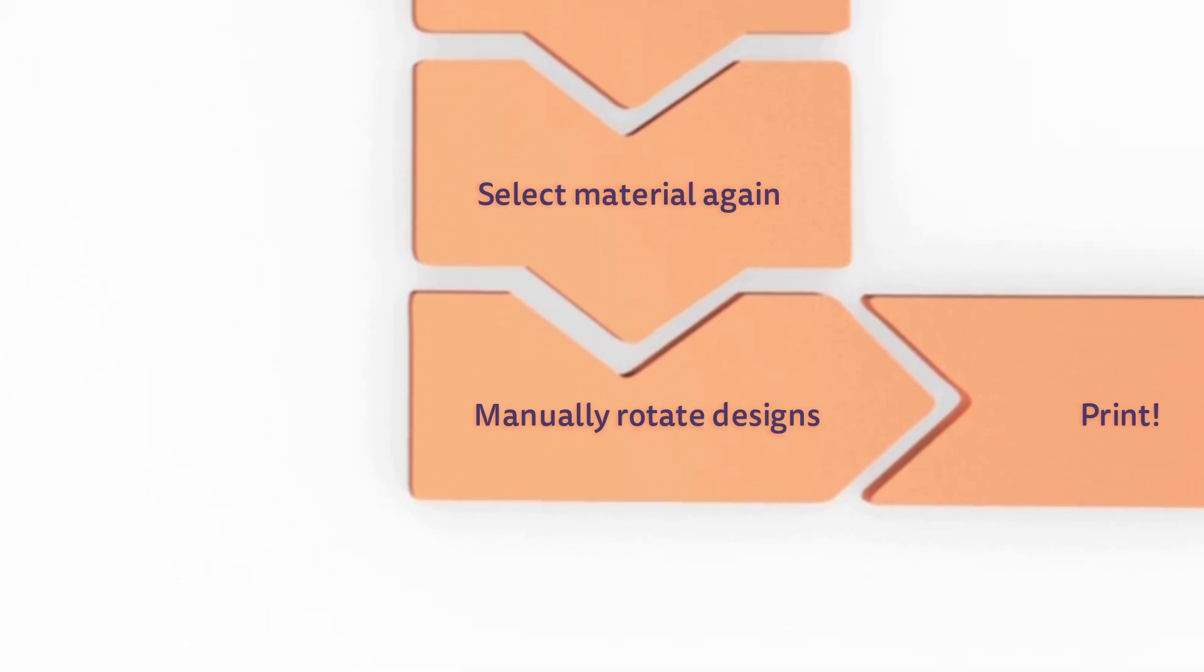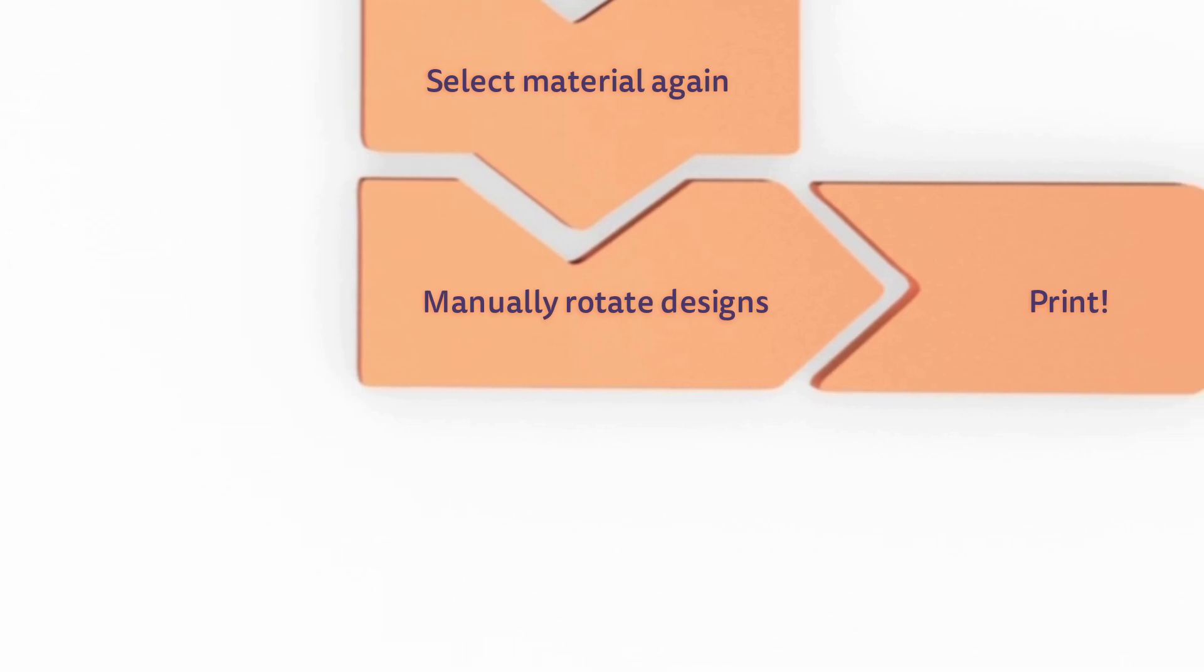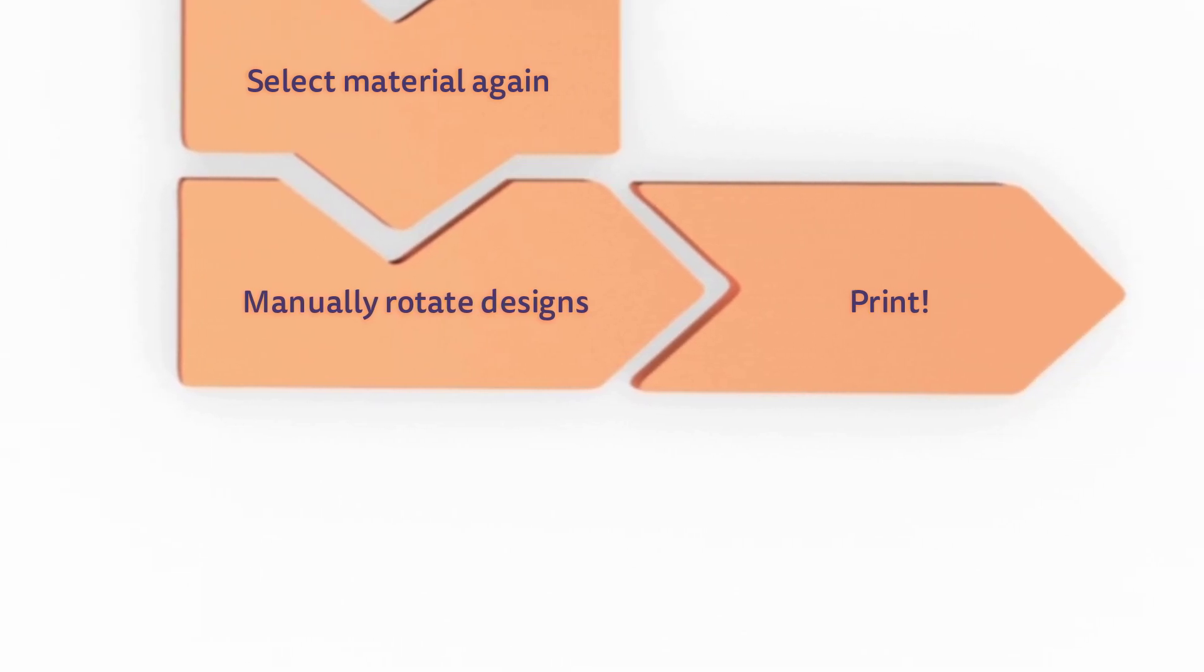Finally, in most cases you must manually rotate the printed objects to correctly position them on the platform for optimal printing. Only then can you start the printing process.